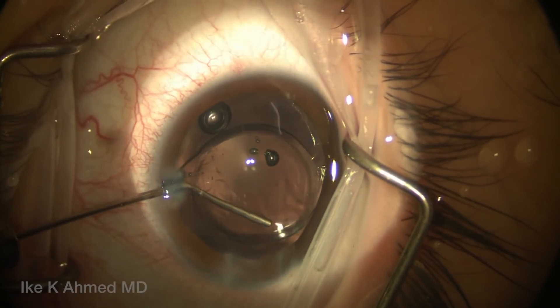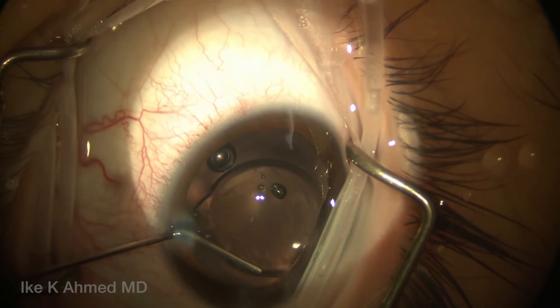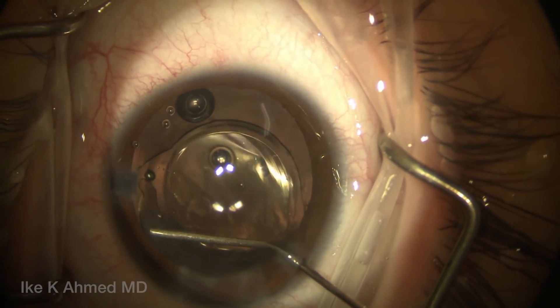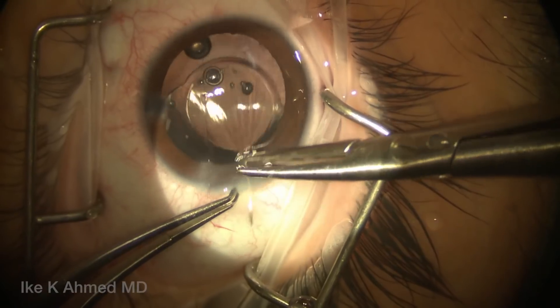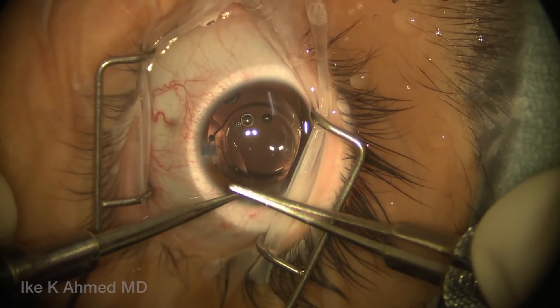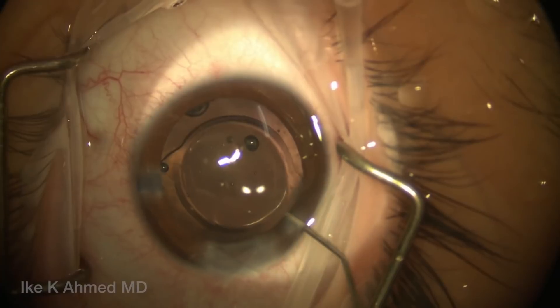We will then remove a little bit of viscoelastic from in front of the optic and behind the anterior capsule, just to remove some of that from the capsular bag. You can see we've used different viscoelastics here — very important to use the right viscoelastics for the right purpose. We've used dispersive, cohesive, and superviscous cohesives as needed, typically using a 10-0 nylon suture to close that incision, which will be temporarily cinched down.